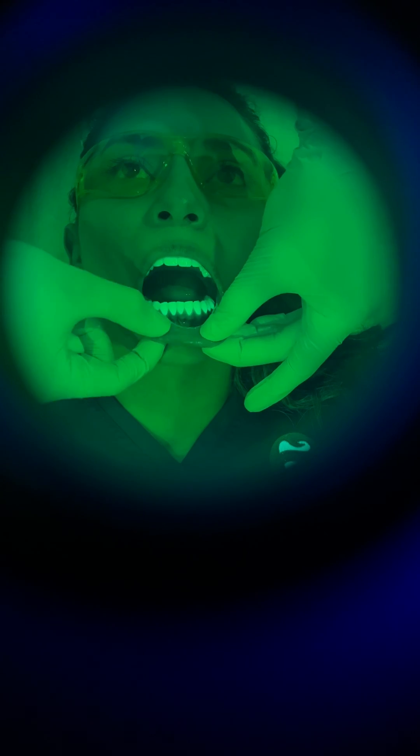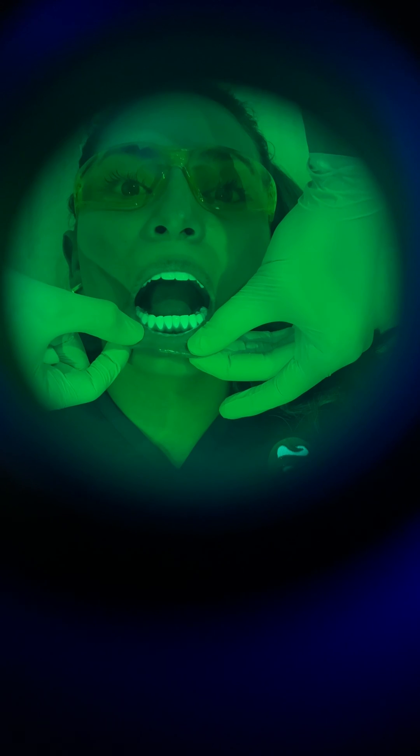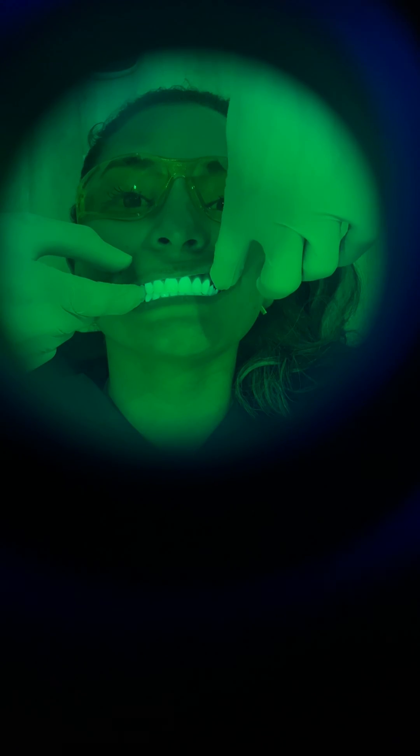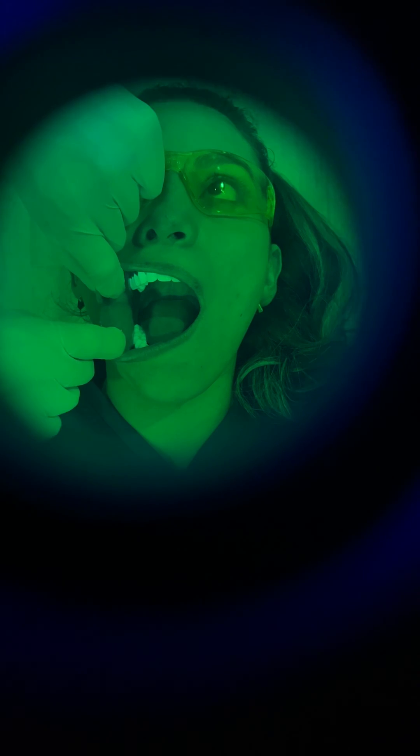We are now ready to move on to the lips. We check the lips — everything looks clear. We go to the upper lips, we ask the patient to close, and we check the upper lips. And finally, we're going to check the cheeks. Open big. We check one side first, and then we check the other side. And everything looks clear.